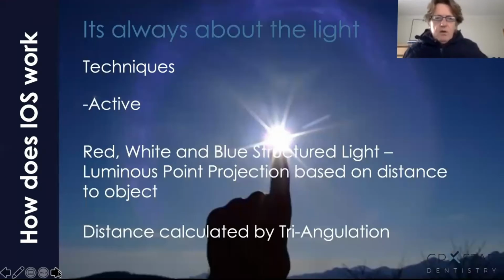The other technique, obviously, is active techniques. And that's now where the dentistry comes in a little bit more. Most of the scanners on the market today, and especially the better scanners, are obviously all based on active light management. And most of these make use of red, white, and blue rays, structured light. In other words, it's directed light. I suppose you can almost call it a laser. It's just the intensity that is different.